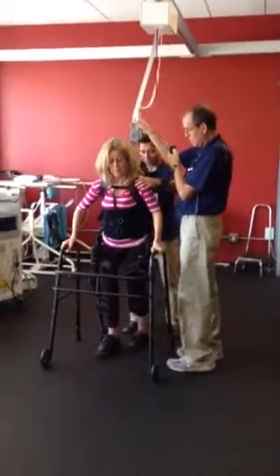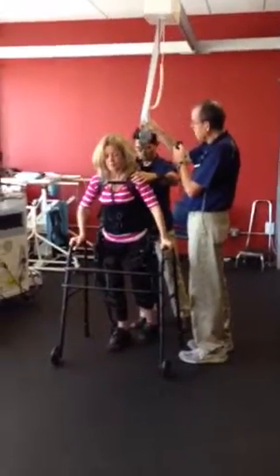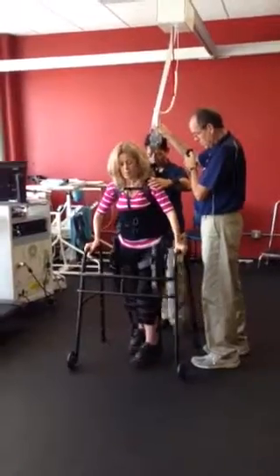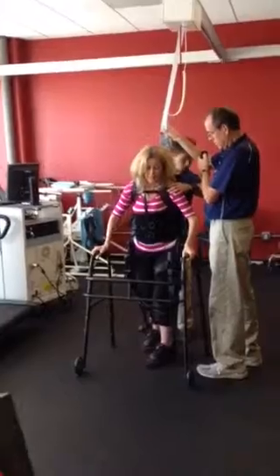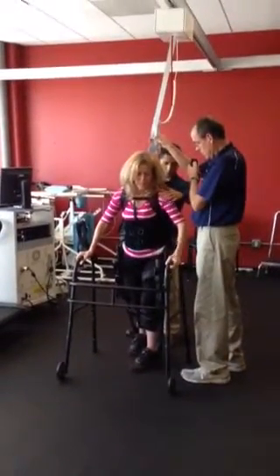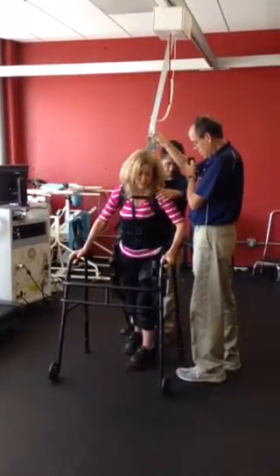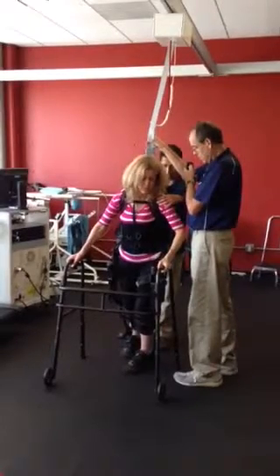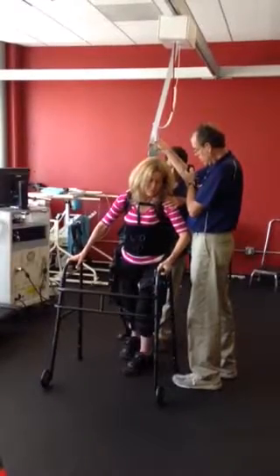Good. Go to the right leg. A little more. Right there. Stay right there. Hold it and step. Good. A little more with the walker. There you go. Only because when you go left and forward you're going to be really close to the right. More left. More forward. Right there. Hold it. Good. See how you're falling off a bit. There you go. Hold it. Perfect. Step.